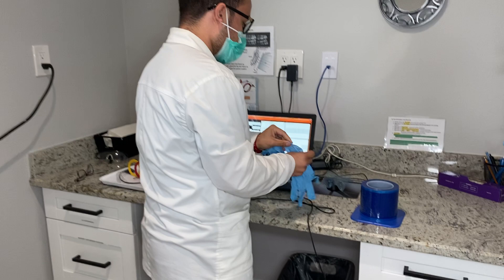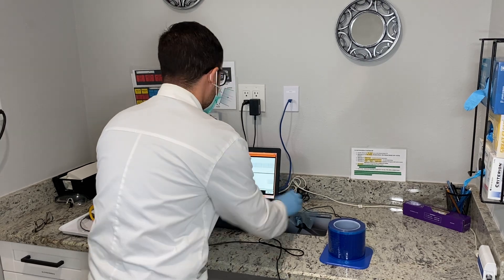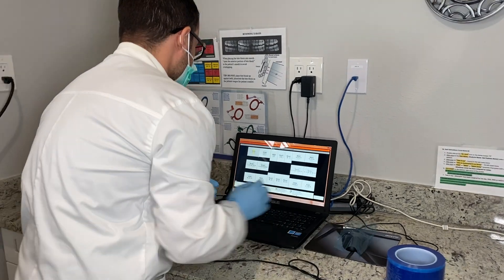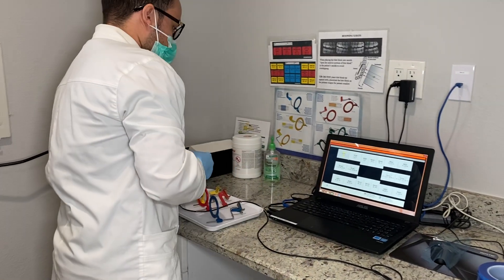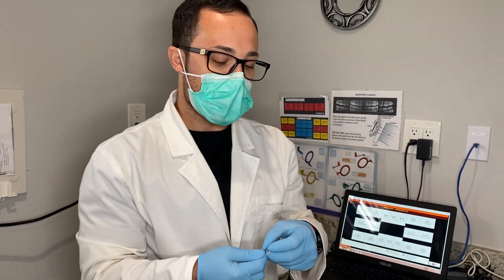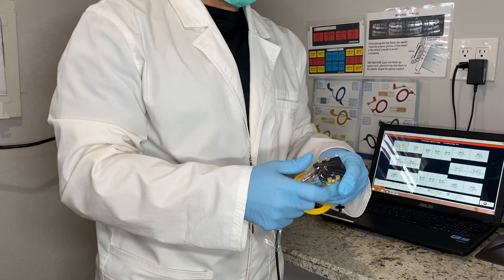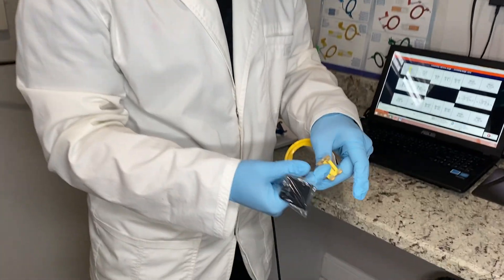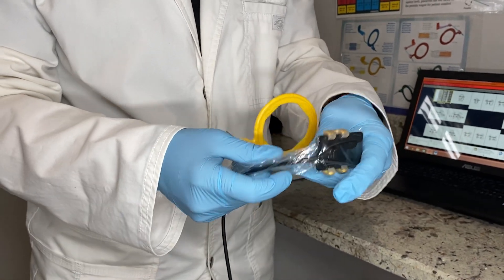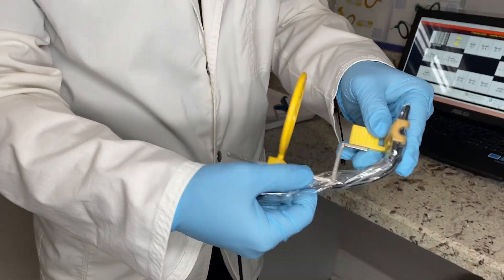Since I already put my barriers on my mouse, I'm going to put some gloves on to click the program and start timing our FMX. Make sure you select the right thing whenever you are starting. One thing I didn't go over: always have a plastic cover on your sensor — if they're digital x-rays, you always want some type of barrier on the sensor. Slide it in; remember these are retractable. Your wire is always with your bar — wire, bar.